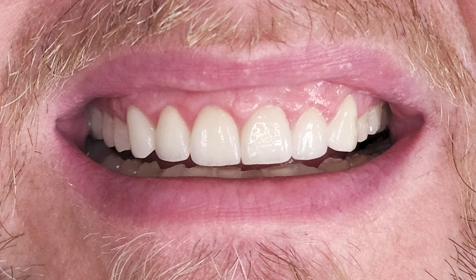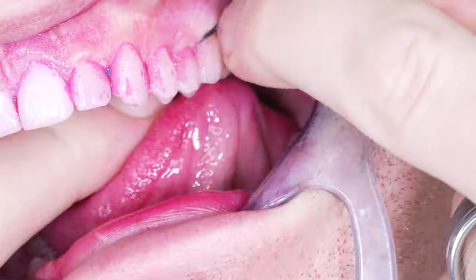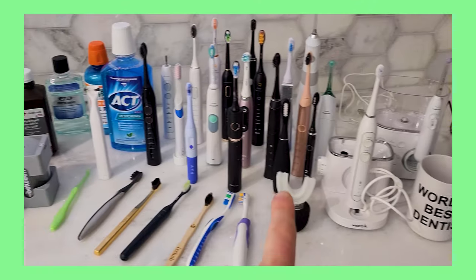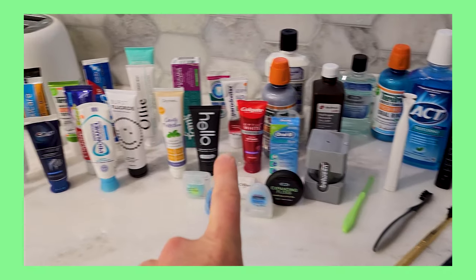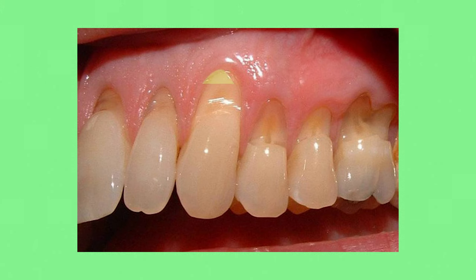You can see how cosmetic and how natural they look at this point. You've got yourself a confident, natural-looking smile ready to impress people and take pictures at the wedding he's going to. Watch my daily dental care video I have posted for the best technique, tips and product recommendations for a stunningly clean mouth that avoids tooth decay.